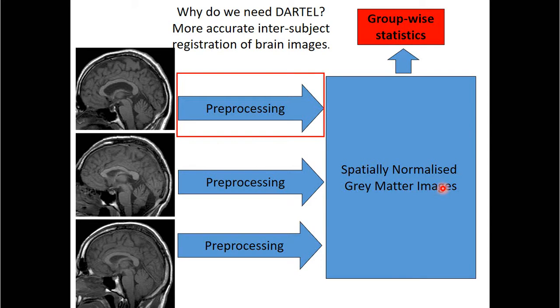And that is why we need DARTEL. DARTEL allows an accurate inter-subject registration of brain images, which is necessary for proper separation of different tissue classes.